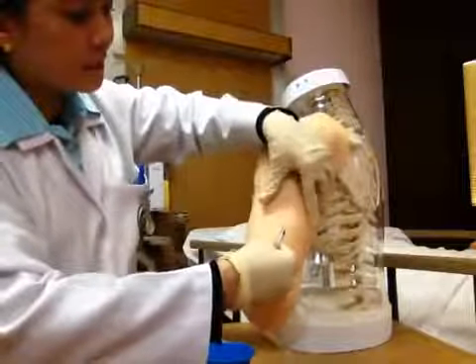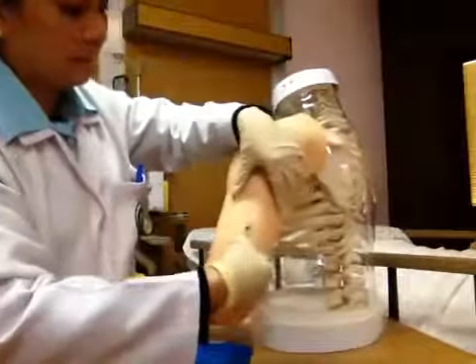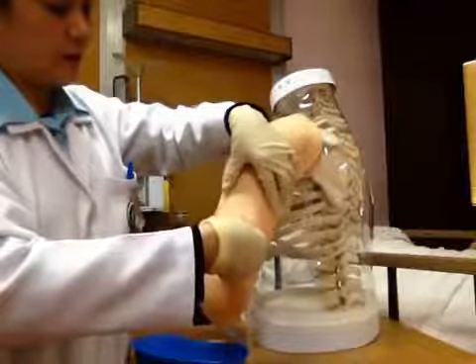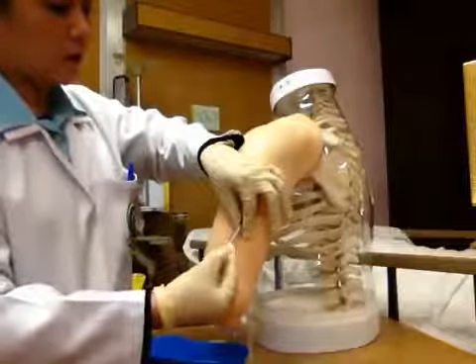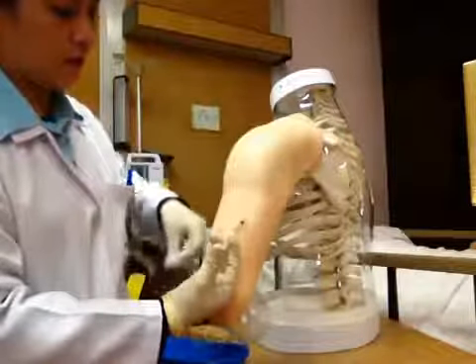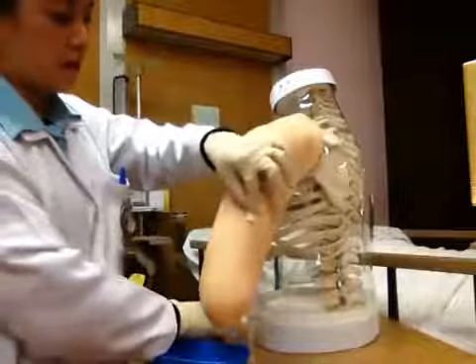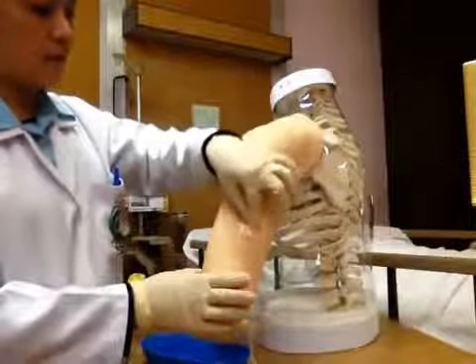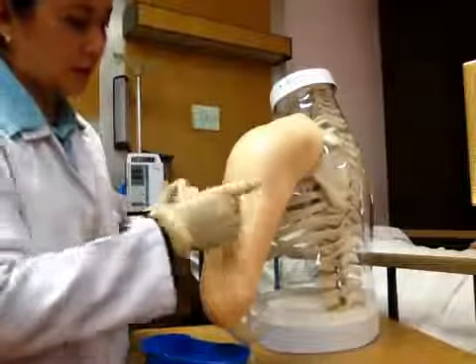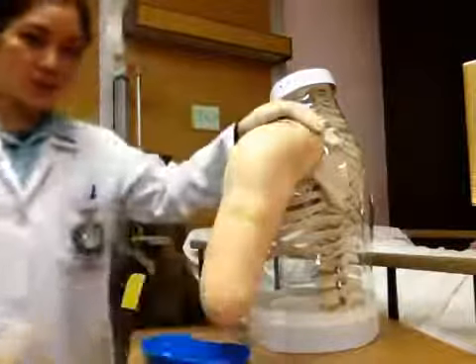Okay, slightly pinch the patient's arm and at a 45 degree angle, as you can see here, inject the medication. Gently aspirate it also and slowly give the medication to your patient. Okay, that is a 45 degree angle. Then remove it and gently rub or massage the patient's site of injection. You can also place the band-aid on the injection site. Okay, so that is how to give subcutaneous injection to our patient.